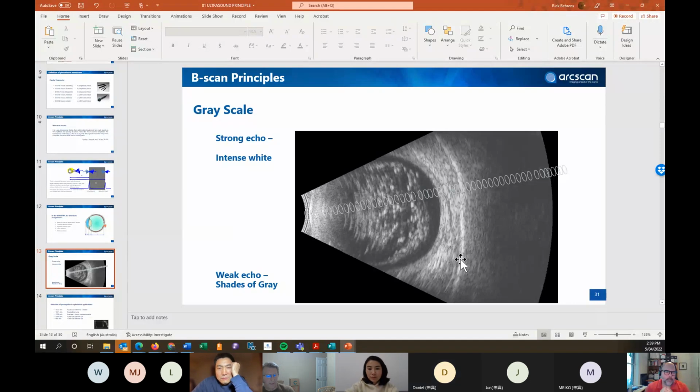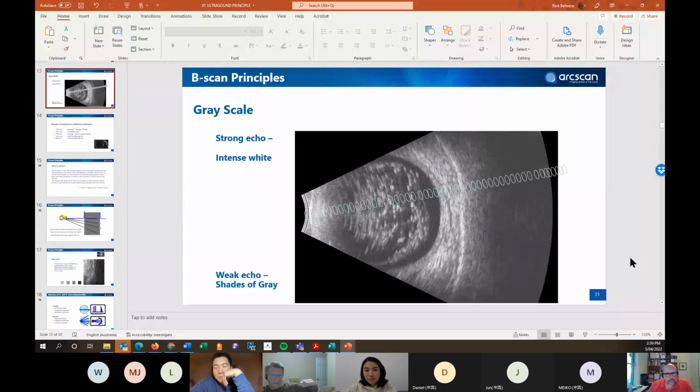Barry? Yeah, so a little bit simpler. As the probe is moving on the arc, the whole plate that the arc rides on moves side to side. So you get this oval shape too. We can actually, instead of an arc this way, do one that goes that way. So we're getting the back of the capsule. We're moving in 5 axes. Okay, axes. Okay, thank you.